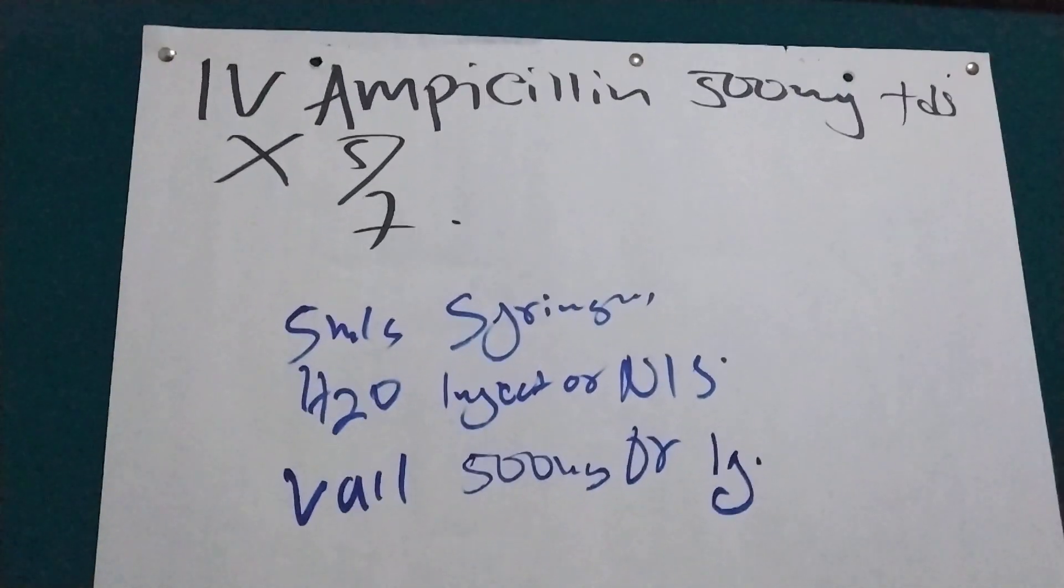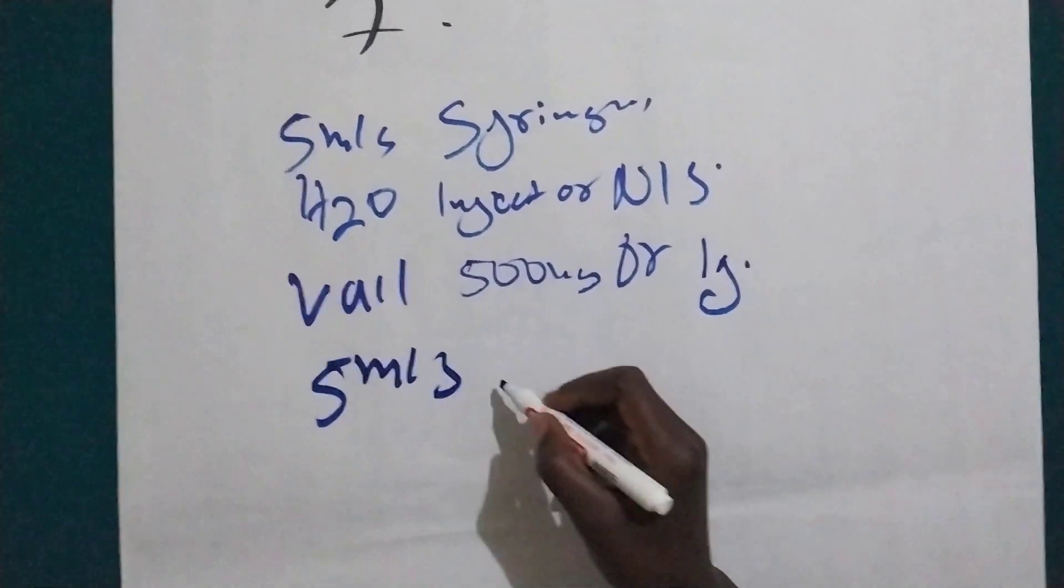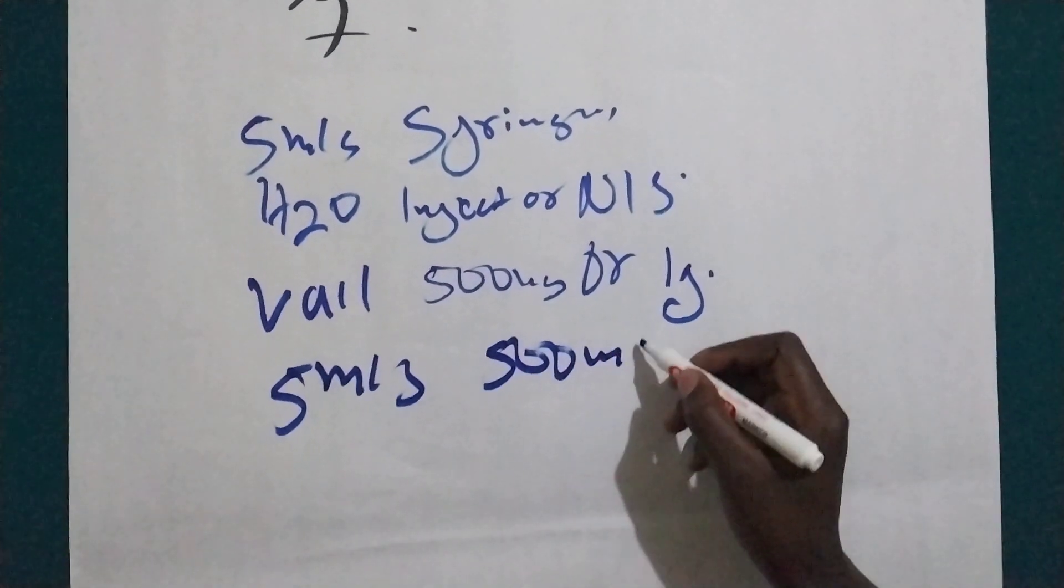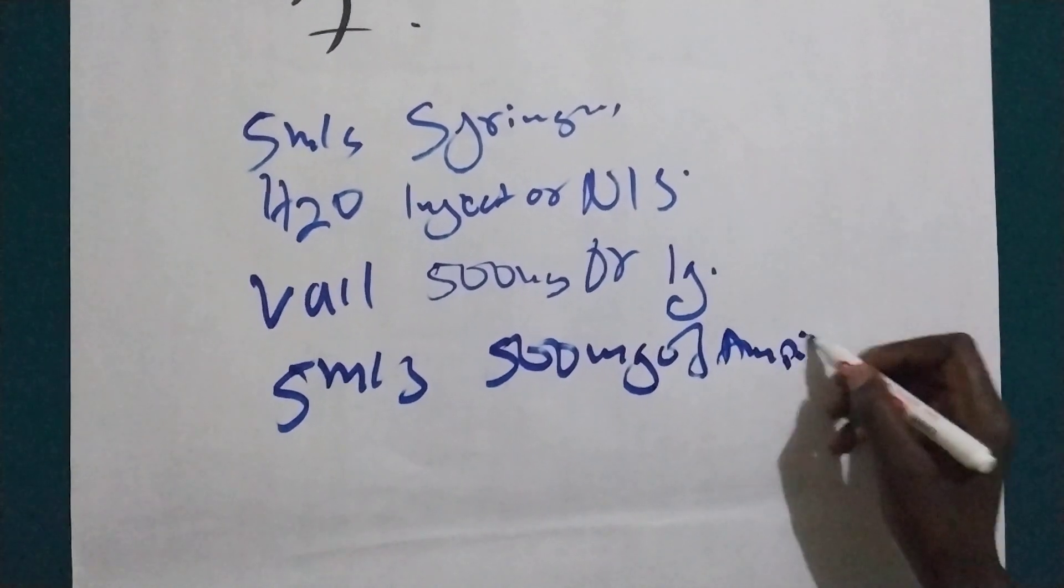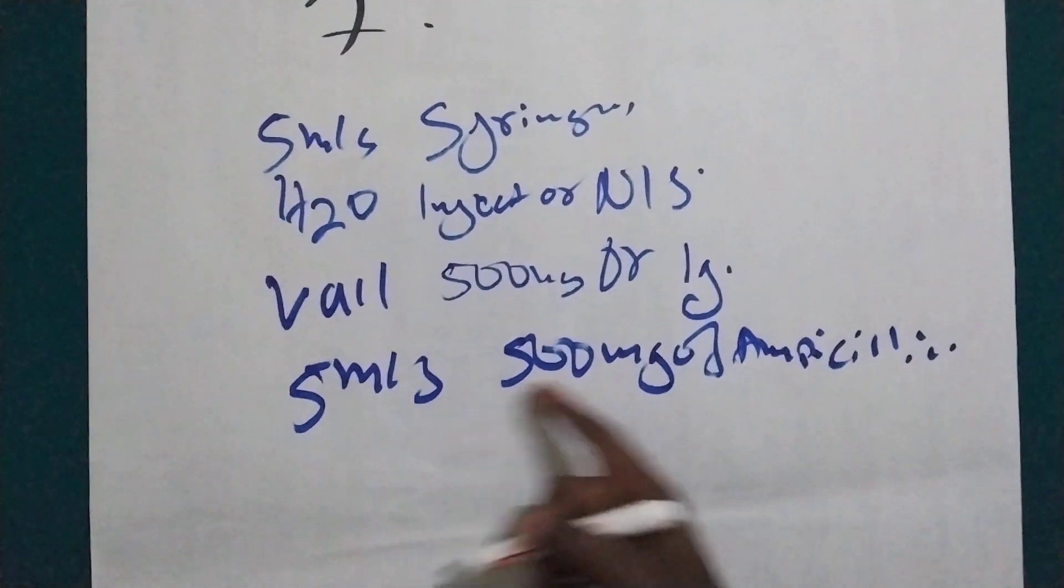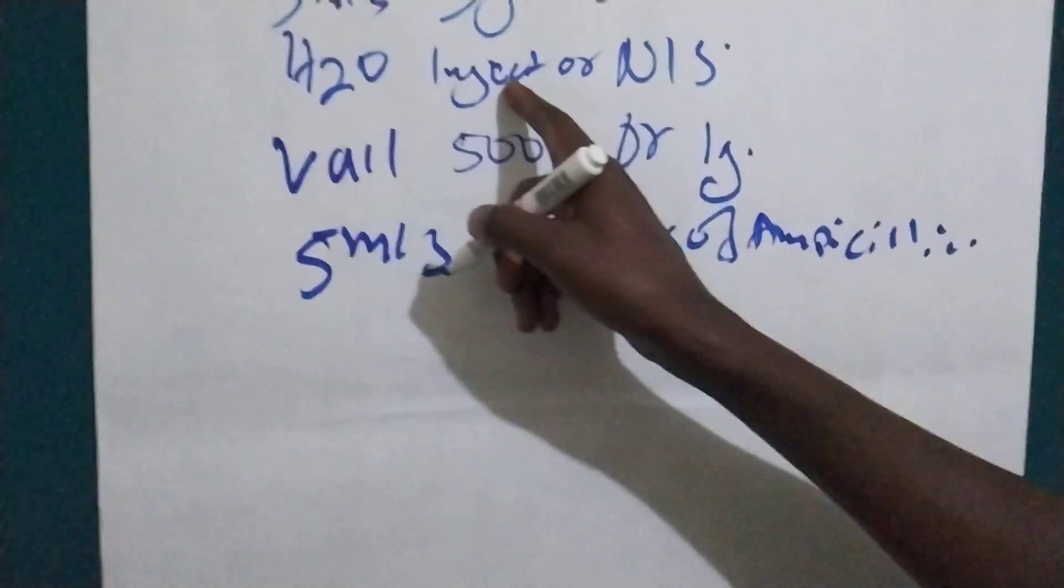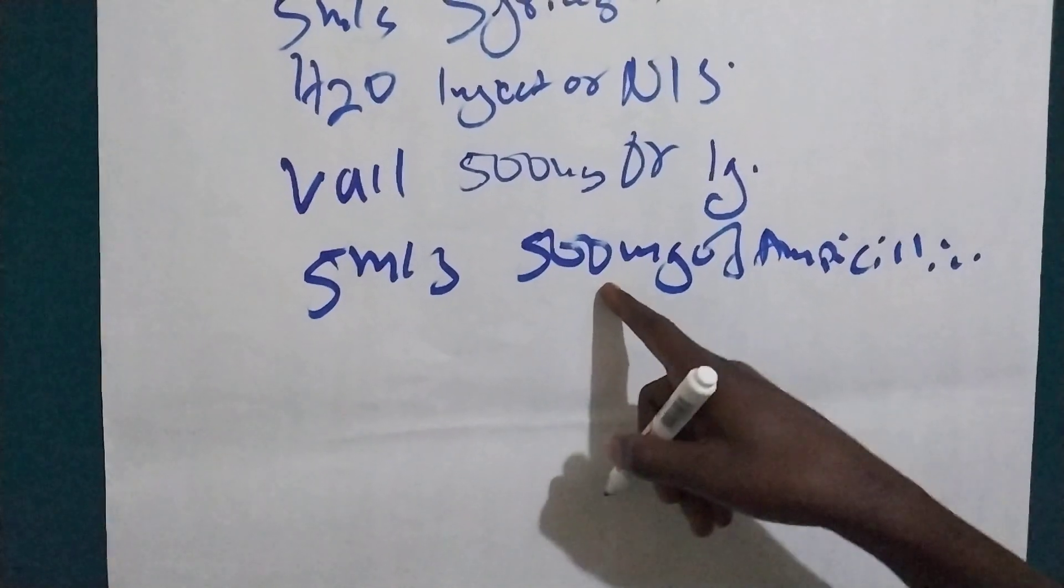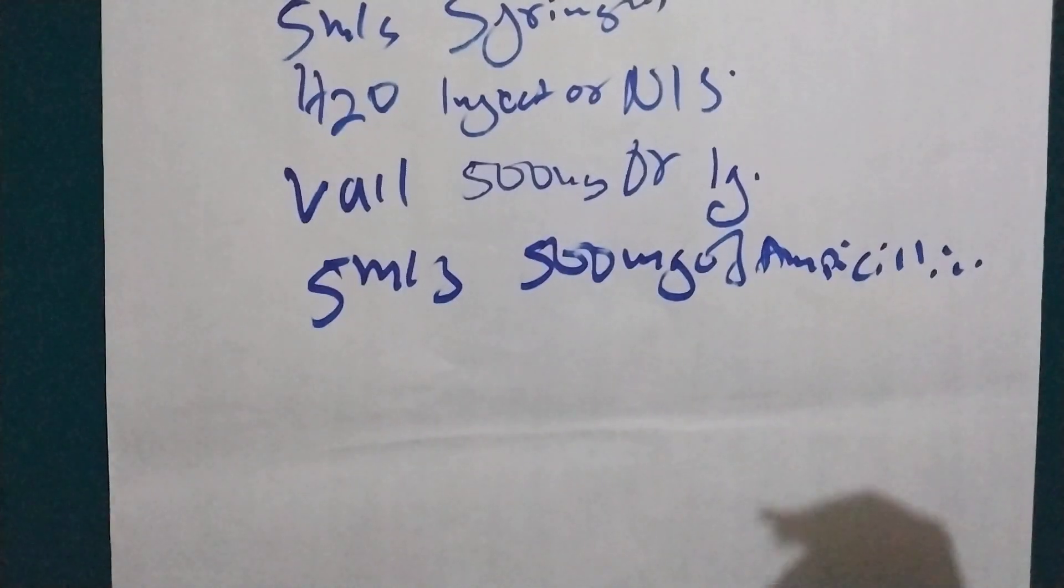So what we are going to do, we are going to use five mils to dilute the 500 milligram of ampicillin. So now if you dilute with five mils, you are going to aspirate five mils of water for injection and you put in the vial containing 500 milligram of ampicillin.